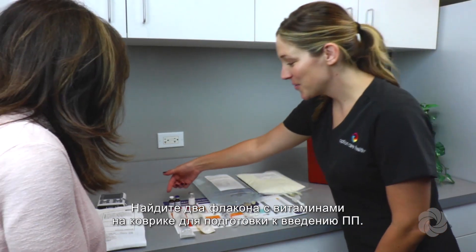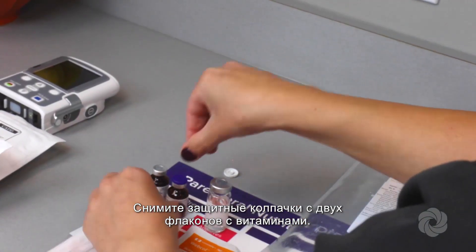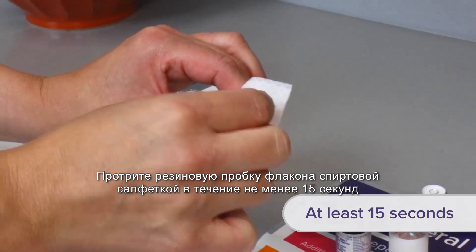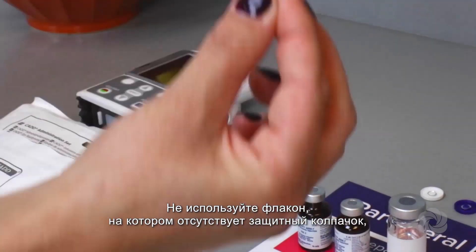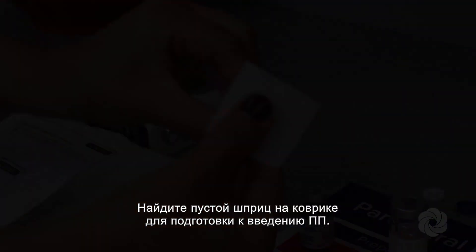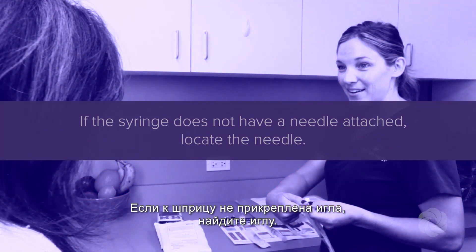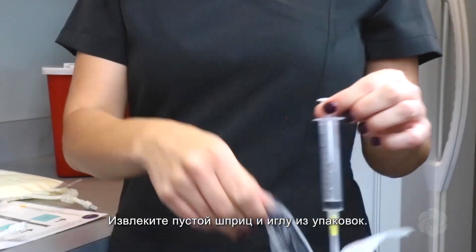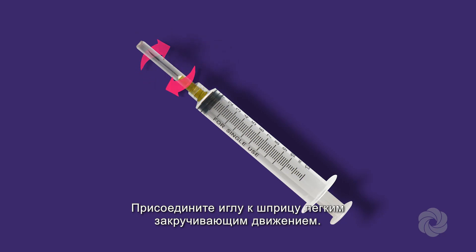Locate the two vitamin vials on your PN preparation mat. Remove the protective caps from the two vitamin vials. Scrub the rubber stoppers of the vials with an alcohol wipe for 15 seconds and allow to air dry. Do not use a vial that is missing a protective cap — promptly call us. Locate the empty syringe on your PN preparation mat. If the syringe does not have a needle attached, locate the needle. Remove the empty syringe and needle from their wrappers and attach the needle to the syringe by twisting gently.